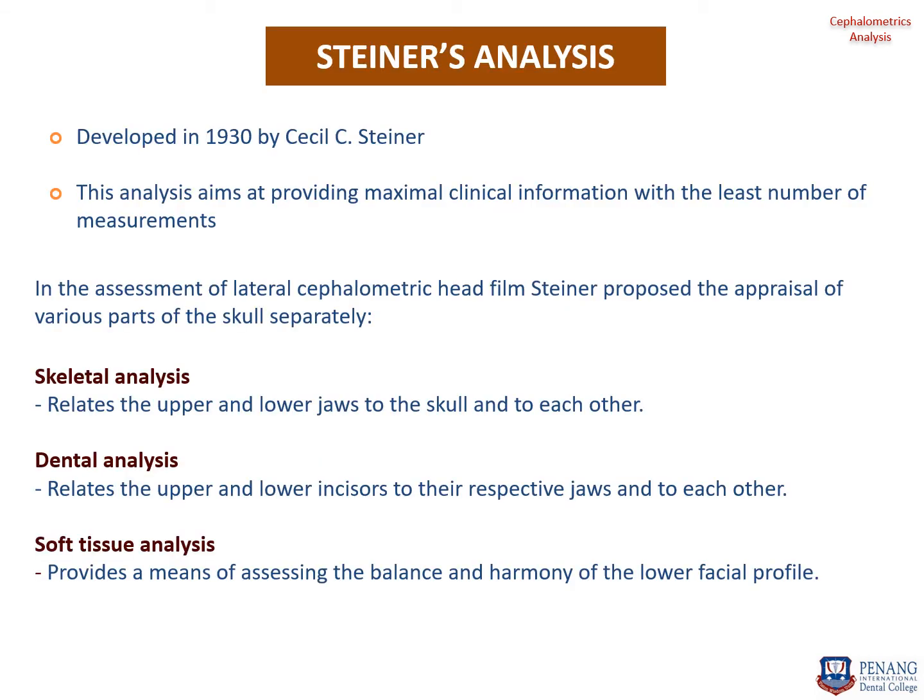Coming to Steiner's analysis, this was developed almost a century ago in 1930 by Cecil C. Steiner. So this analysis will help by providing maximal clinical information with the least number of measurements. It also helps in the assessment of the lateral cephalogram by utilizing three different analyses, which are skeletal analysis, dental analysis, and soft tissue analysis.